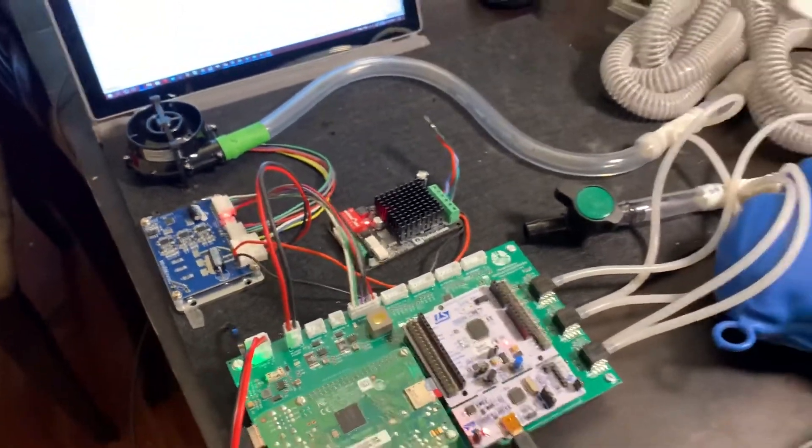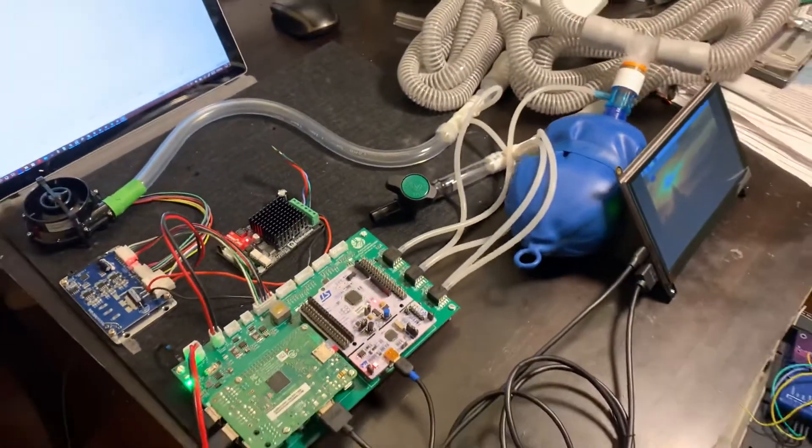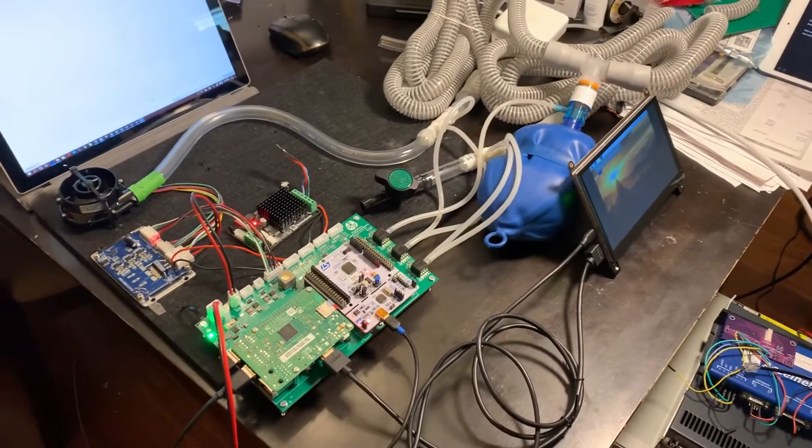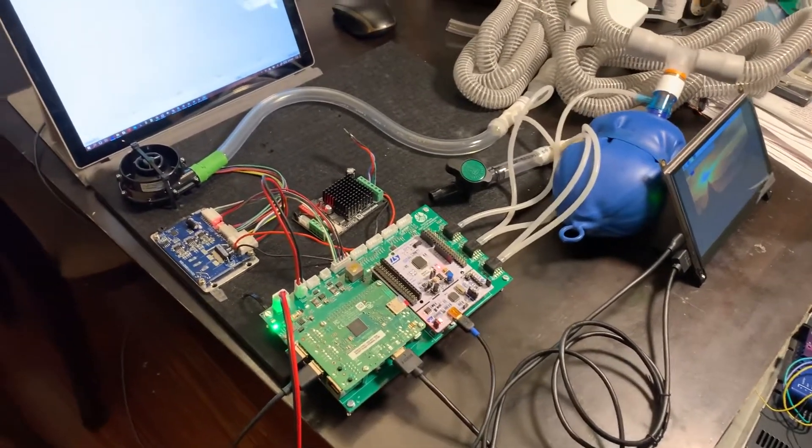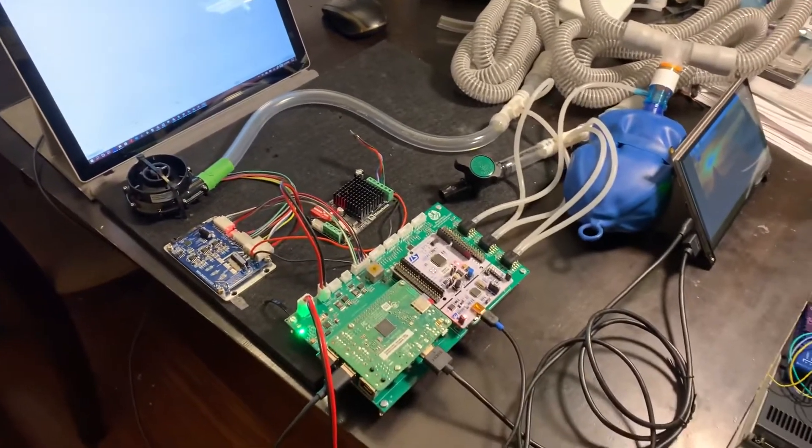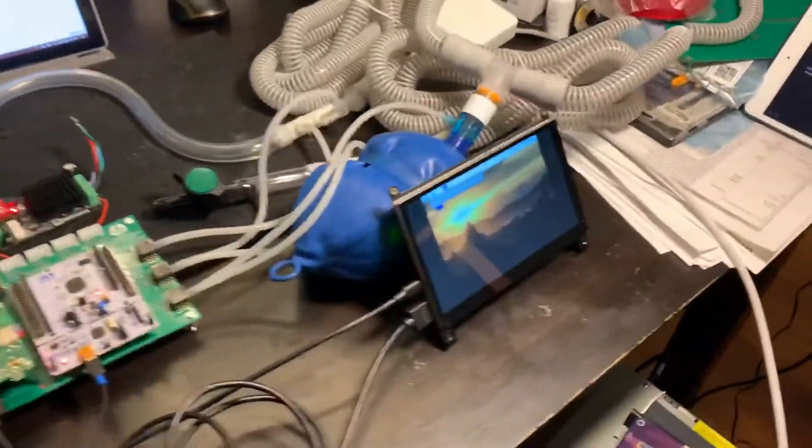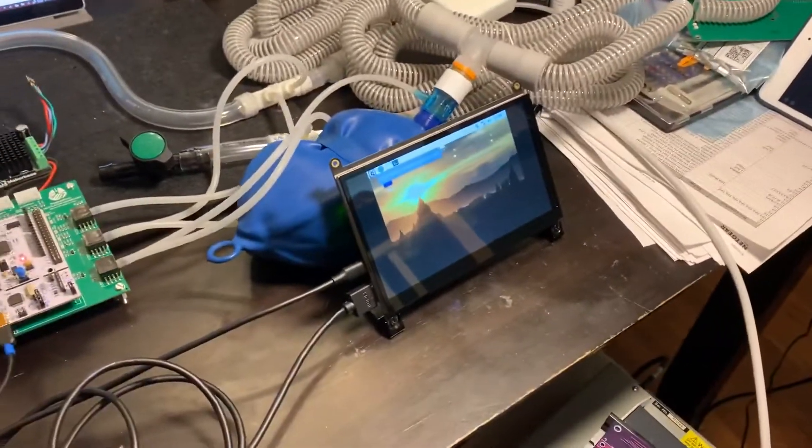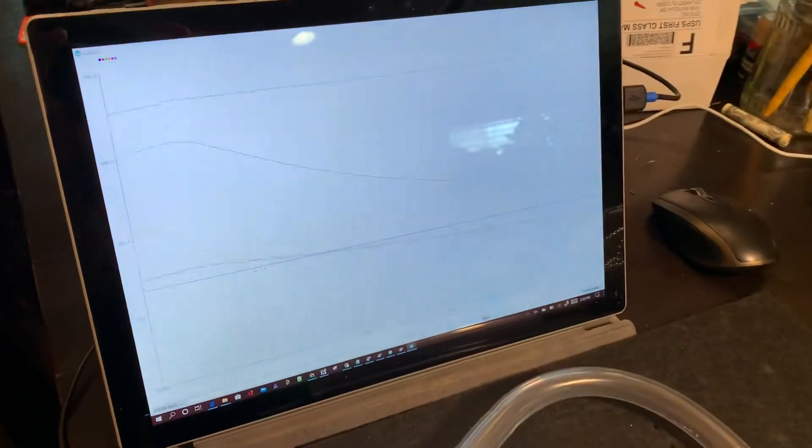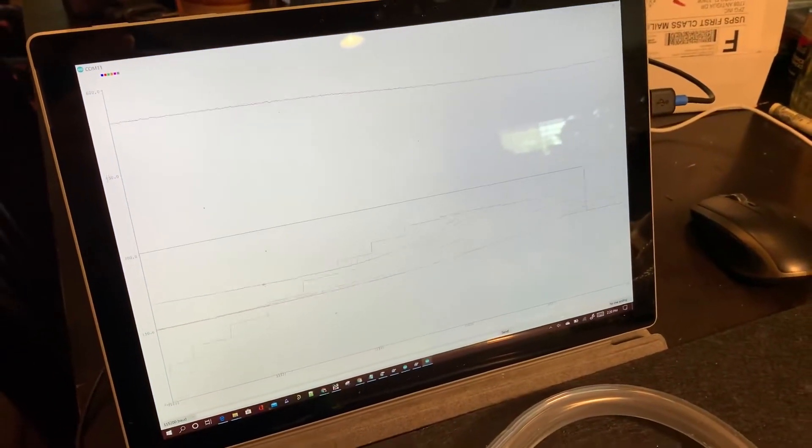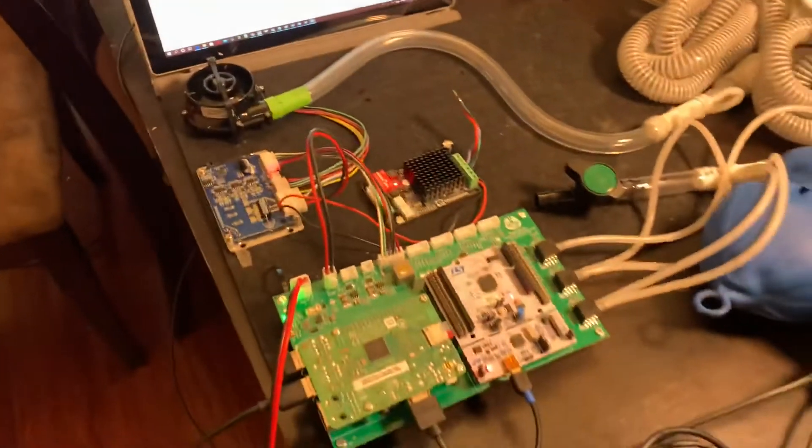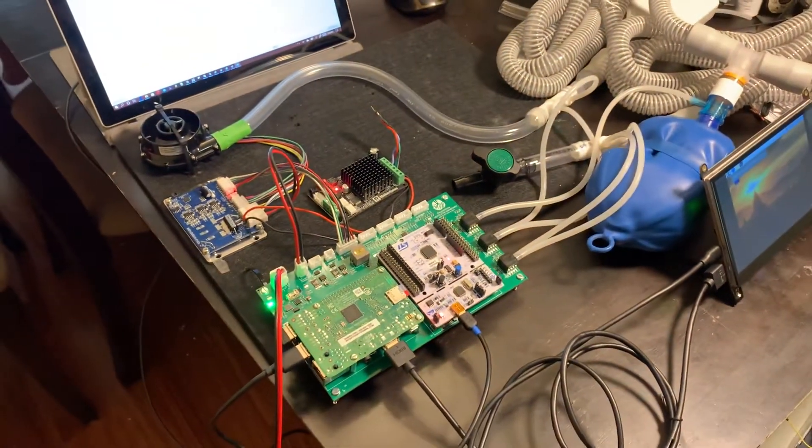Here we see a basic prototype demonstrating closed-loop pressure control using the new processor and main board. The interface computer is also hooked up here and we also have a data plot showing the control cycle. And that's the new main board.